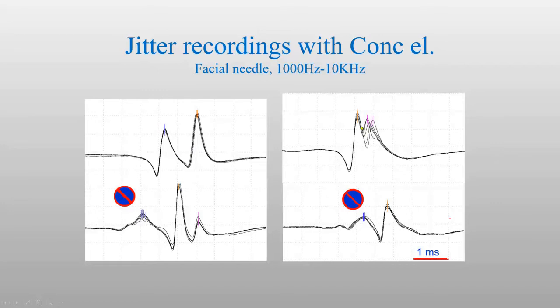This is another recording where the signals here are parallel, but they are riding on each other. This is acceptable for the peak triggering, but not for the amplitude level analysis.